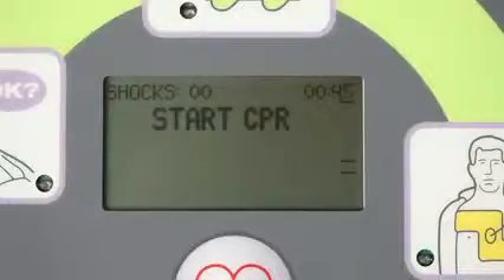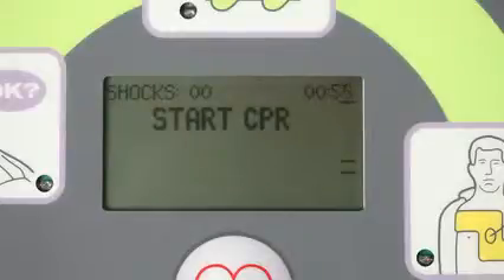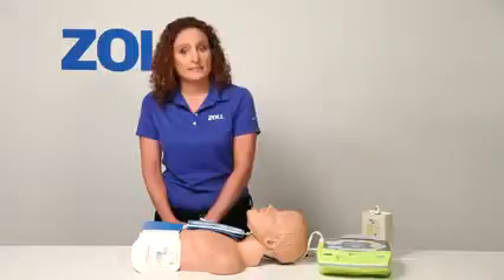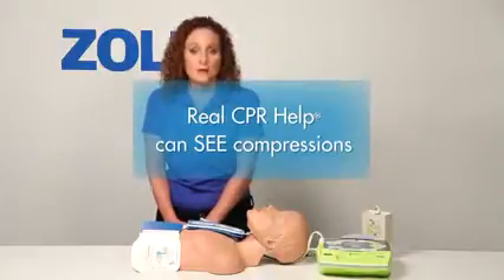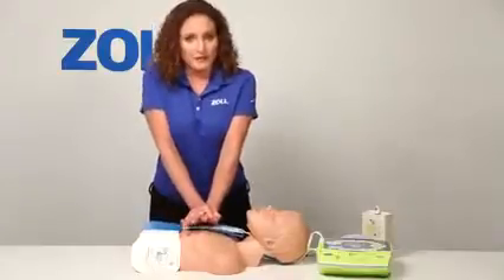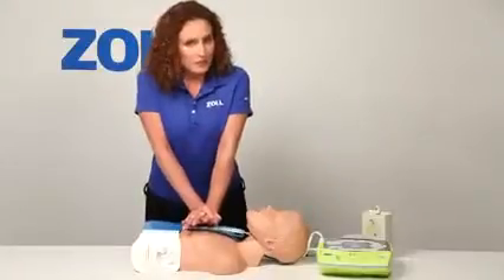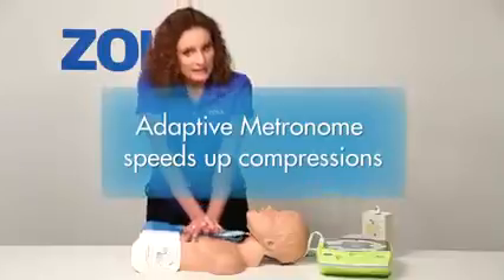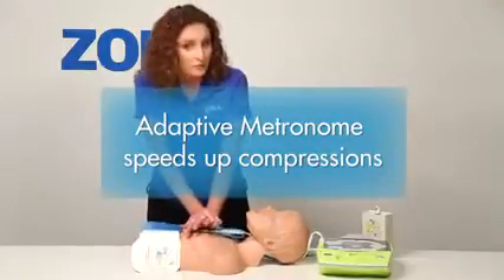The AED Plus repeats the prompt to start CPR every 10 seconds, because our AED has a technology called Real CPR Help. The AED Plus sees that I've not yet begun chest compressions. When I do start CPR, it will see my chest compressions and will help me do good CPR in a way that no other AED can. Notice the bar gauge on the display as I start chest compressions.